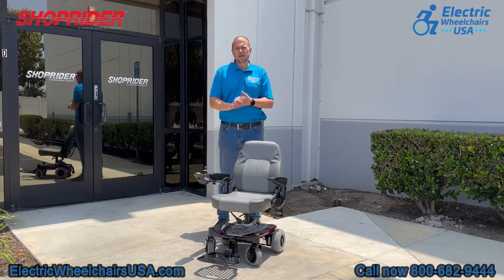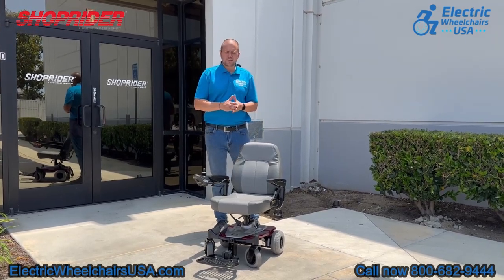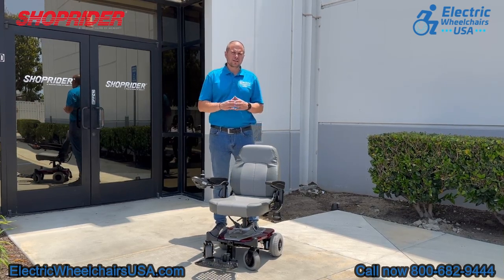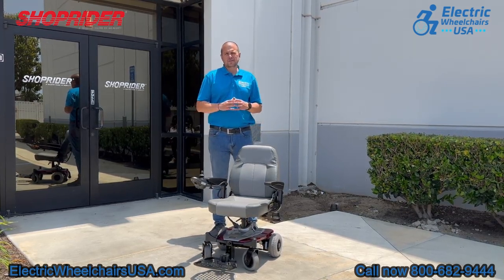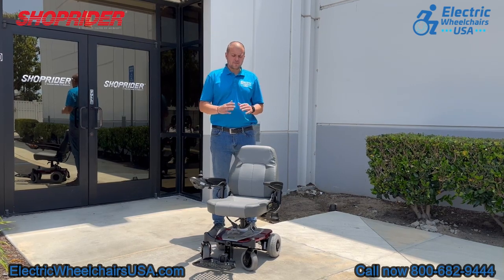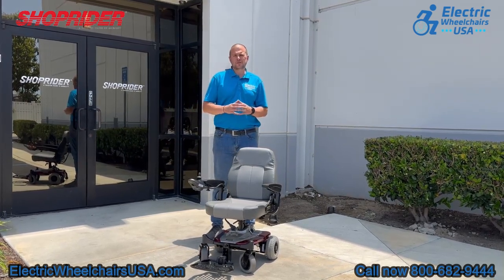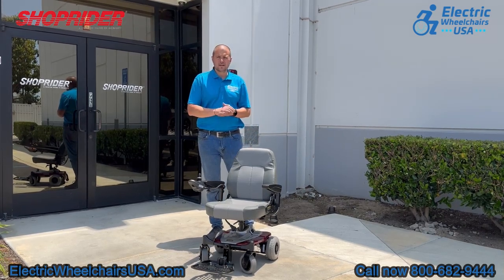The heaviest piece is around 35 pounds. It has a 250-pound weight capacity, but one thing that makes it different is that it has an environmentally friendly battery technology, so the lifespan of the batteries with the Smarty is traditionally longer than most other sealed lead-acid batteries that are on the market today.